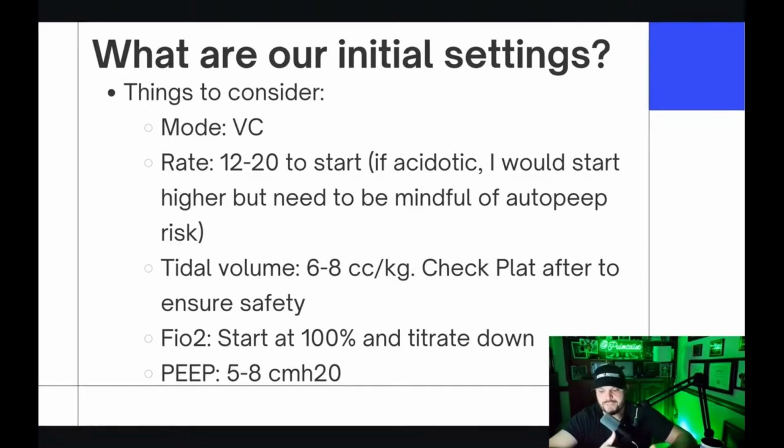I'm not going to put them on a rate of 12, right? I'm going to put them on a higher rate. What that is, I don't know. 15, 18, like I said, 20, something like that. So a lot of times when I set the rate, it's mostly vibes.